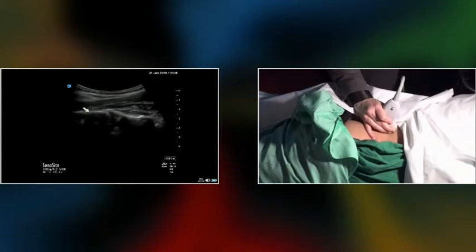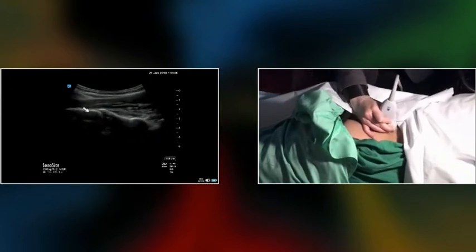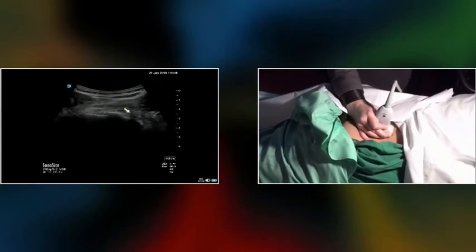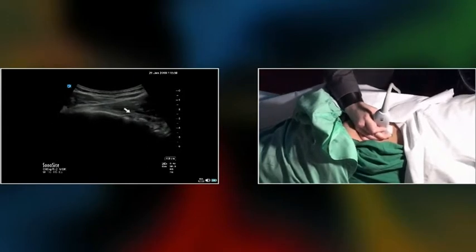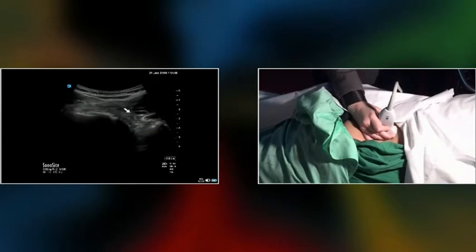And then S3. So as we all know, we usually block the SI joint at the S2, S3 level. That's usually the area. And if we aim for radiofrequency ablation, it's very important that we try to avoid the sacral foramen level. So we would like to move a little bit more lateral until we cannot see the sacral foramen. And then we put the needle for the RF. So that's a combined use of ultrasound together with fluoroscopic ablative therapy technique, apart from the diagnostic block of the SI joint. Yeah, that's something additional.